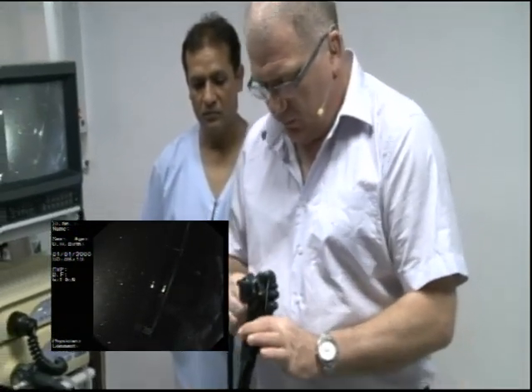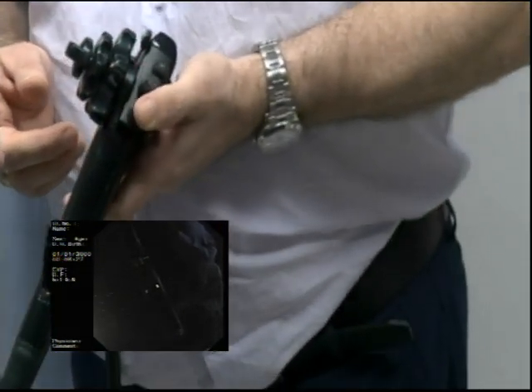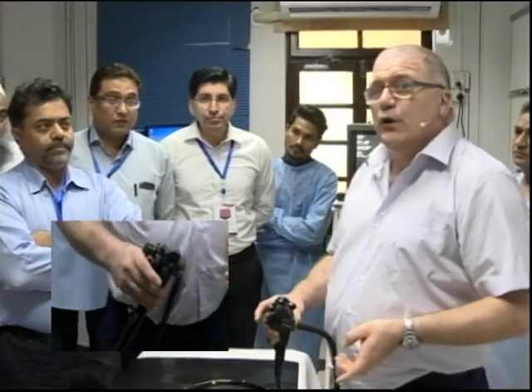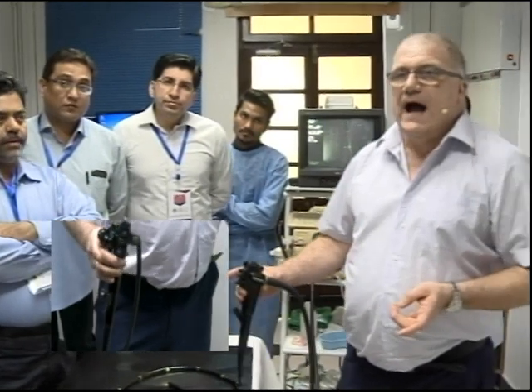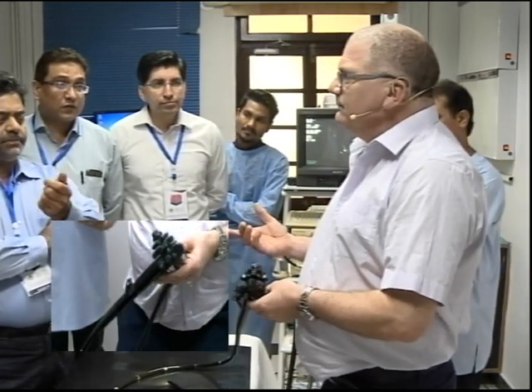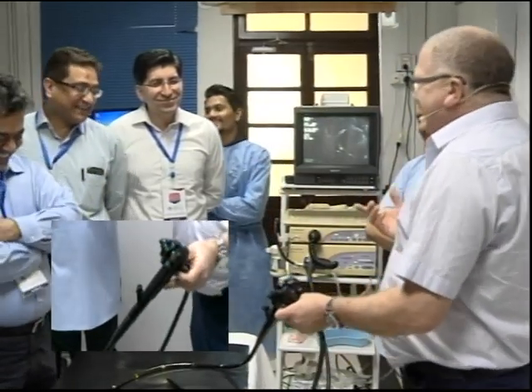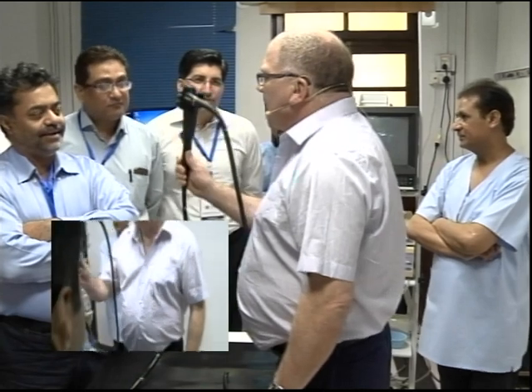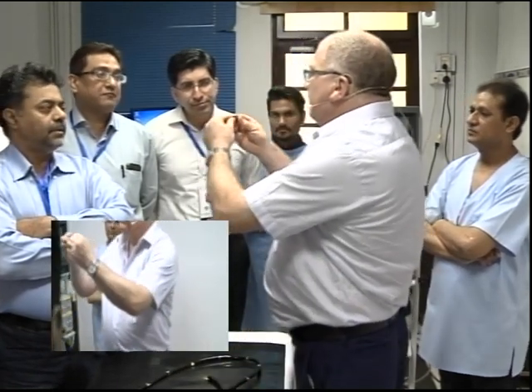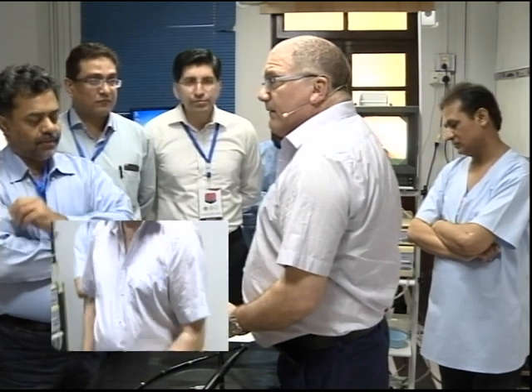Now, on the scope, what have we got? What's this button? Suction. This button? Okay. How does it work? What does it do? How? When you just put your finger, it gives the gas on the air. How? So, can you hear the noise? Yeah. That's not suction. The air is actually coming out this button here. Can you see the hole? When you cover this, the air can no longer escape, and the air goes down there and then comes out at the end. Okay?